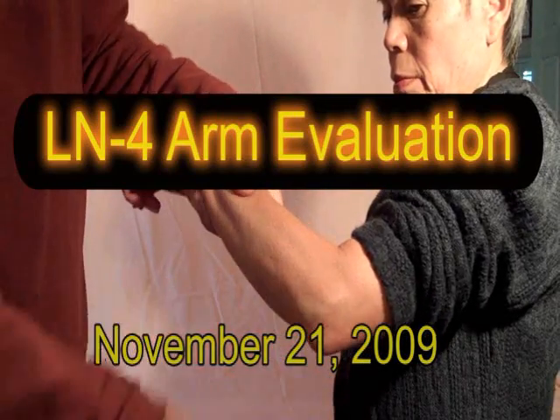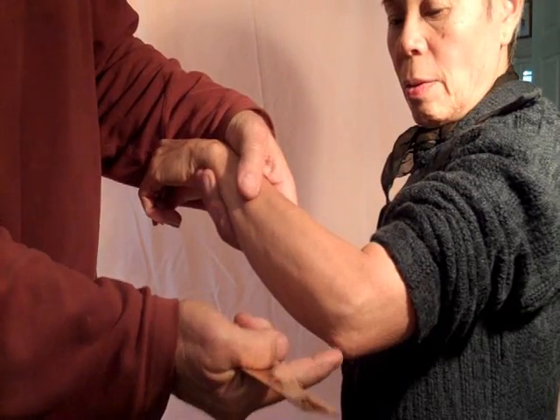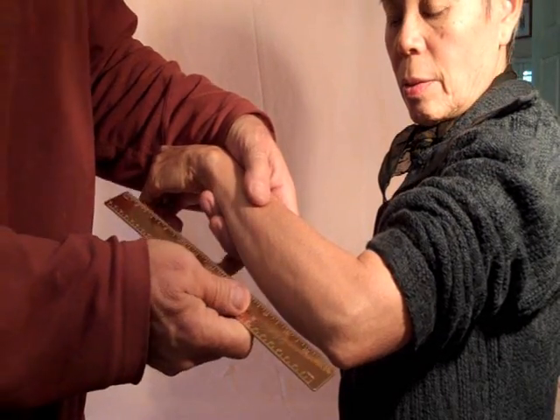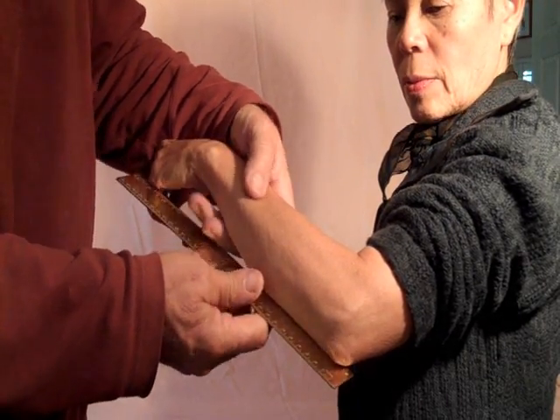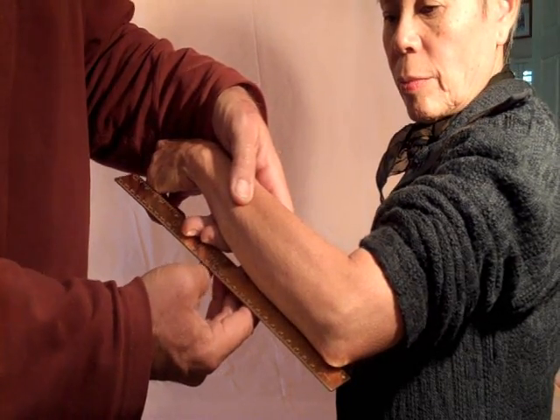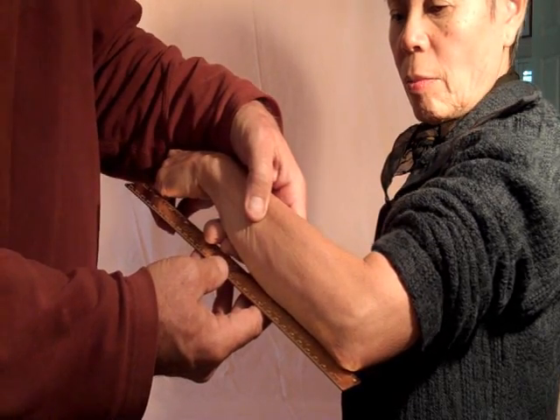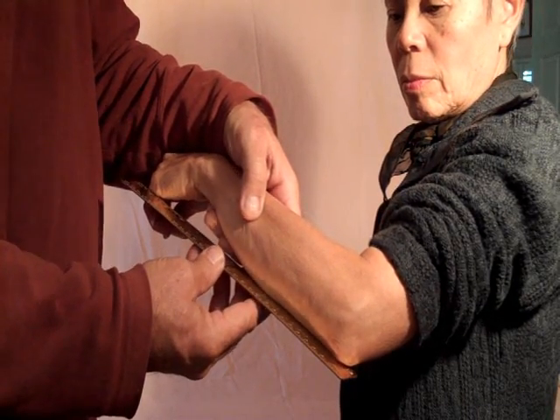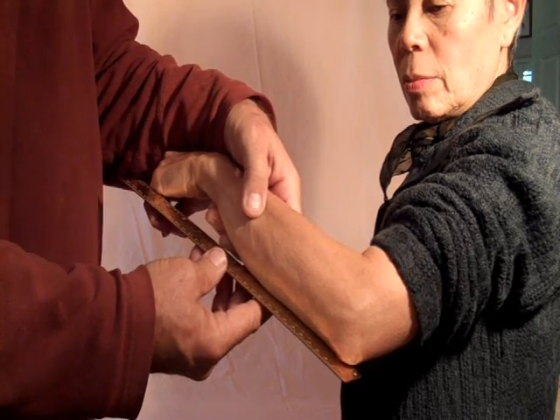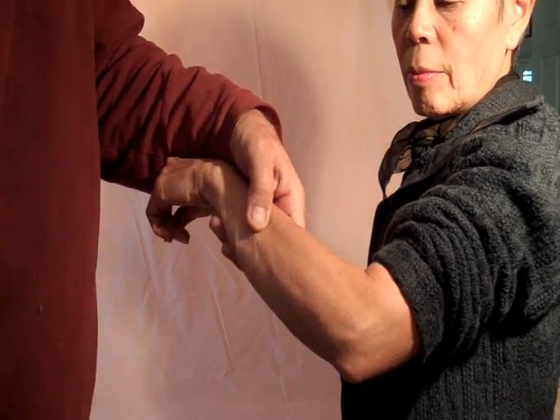We need to see the arm, and I use an ordinary ruler and measure from the tip of the elbow — 14 centimeters, from 1 to 14. So in this case, that's about here on this individual. I do it in a public way so that the other people waiting to receive an LN4 and see if they qualify will observe the process.